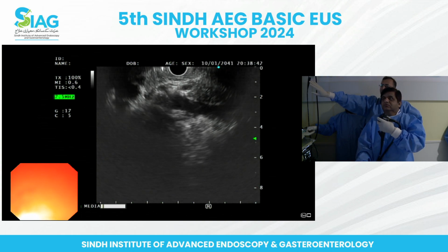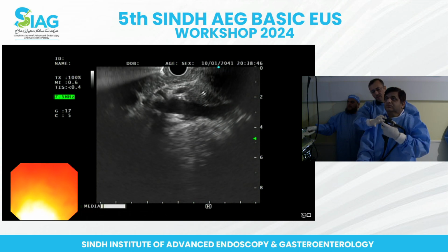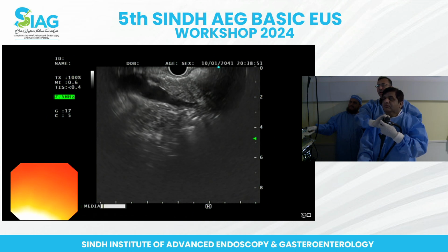On the right hand side, like this, there's the spleno-mesenteric vein. So big wheel up, big wheel up, up, up.